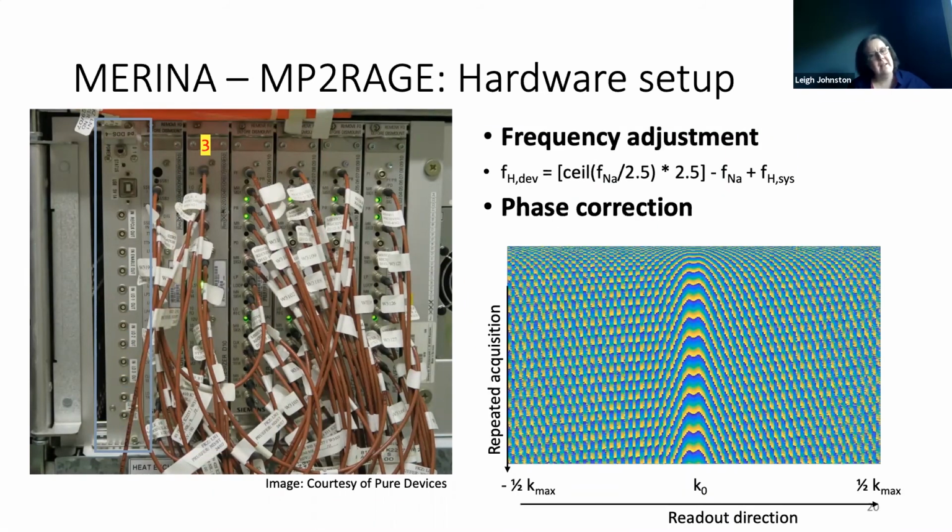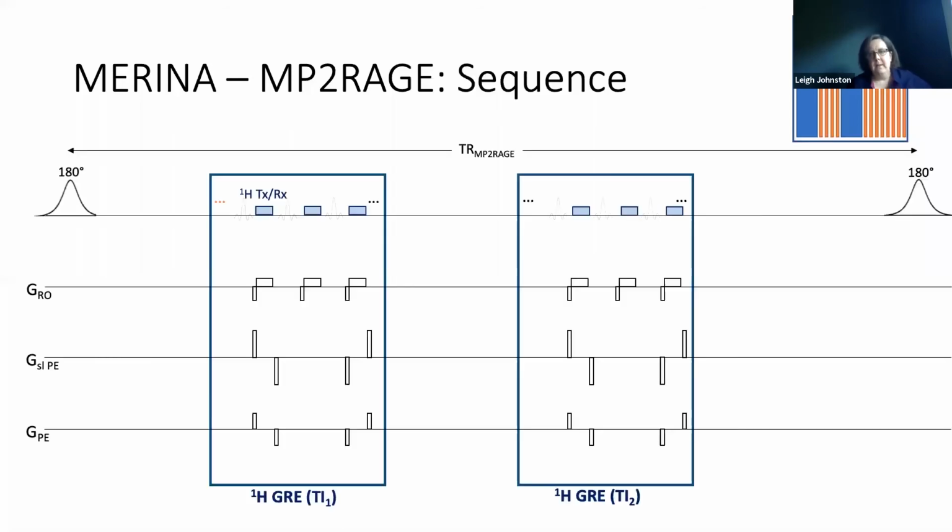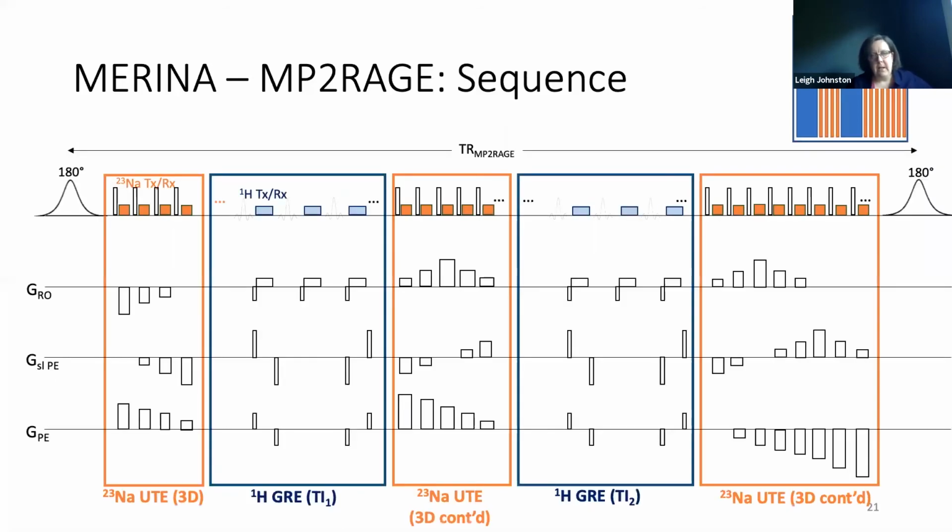Okay. And then, of course, nothing works as you would expect it. And there's a bunch of adjustments that you need. Inside the scanner, you've got the sequence that plays out the magnetization, the B1 applications, and then you've got the image reconstruction. What we're talking about is in between those two things, there are some adjustments that have to be done to get it all working happily.